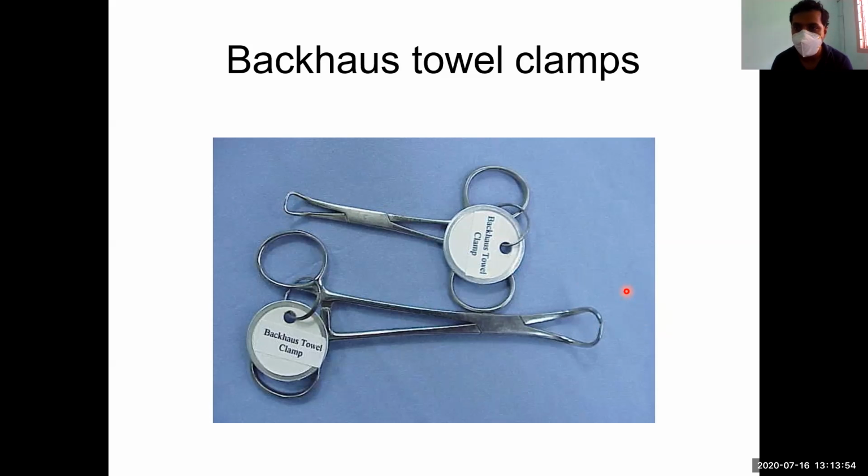Do any one of you have any query? Not only in laparoscopic operations, but also in open operations, like exploratory laparotomy and any kind of normal surgical procedures, we use these towel clamps to fix those wires with the drape sheets. One more function: we can use these as a tongue retractor. During various ENT procedures, you can hold the tongue with this and pull it. Sometimes in hernia operations, although it is not made for this specific purpose, we can use this as a cord clamp.